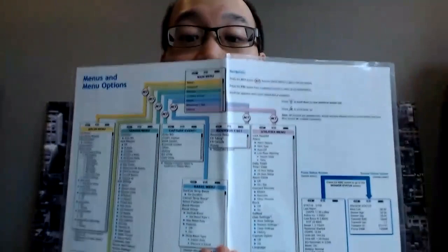This is the summary of all the functions that you can do. So you can see it's pretty complicated. Sometimes I've got seniors who come see me and say, "Oh, hey, I heard about that insulin pump. I want to use it." And depending on how good they are with technology, I'll recommend it or not for type 1 seniors. But my general rule is that if they are not able to use a smartphone, then generally you can't use these. You do need these to function correctly, or else you could go into DKA. And I'm going to talk more about that in the next section of my video.